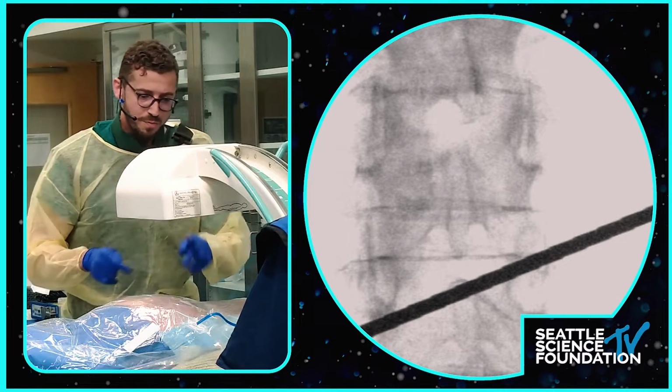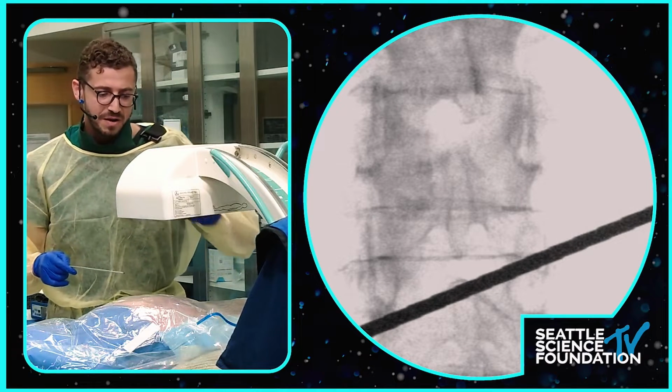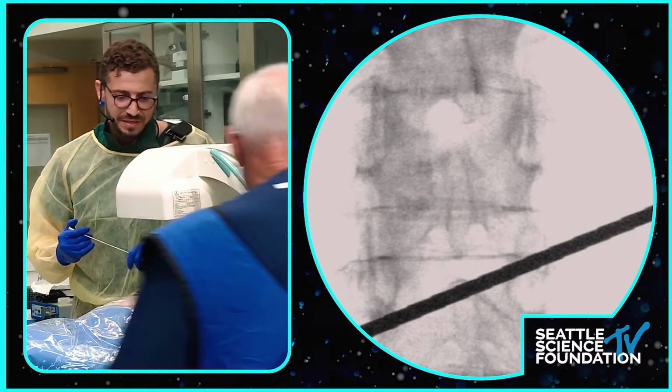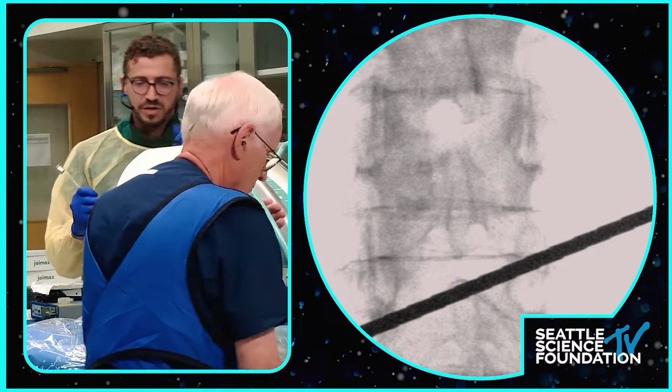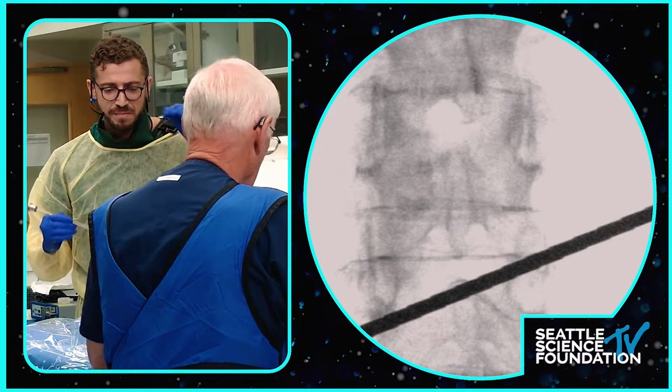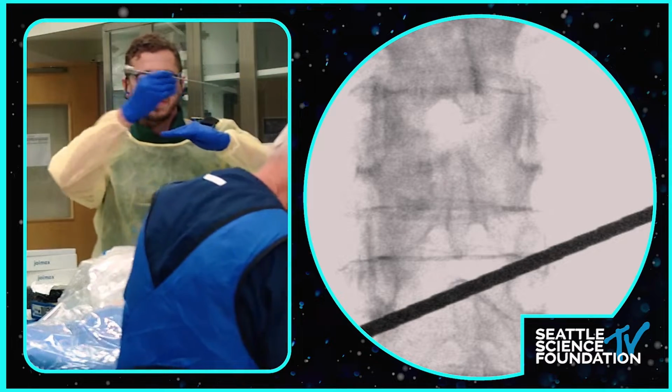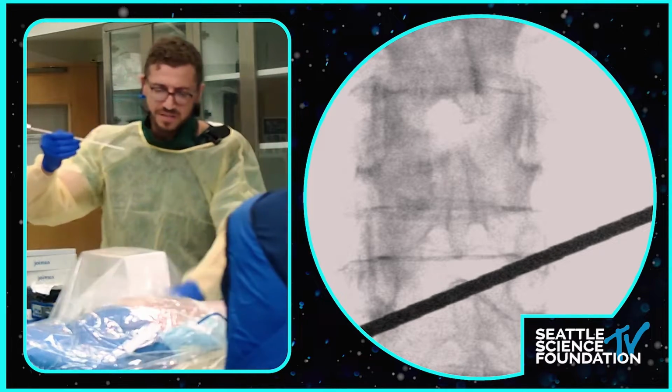Then you put your incision based on the landmarks we talked about, but the best way of doing it is, can you do a lateral, please? You want your approach angle on the lateral to be between the line that joins the facet joints and the line that joins the spinous processes.